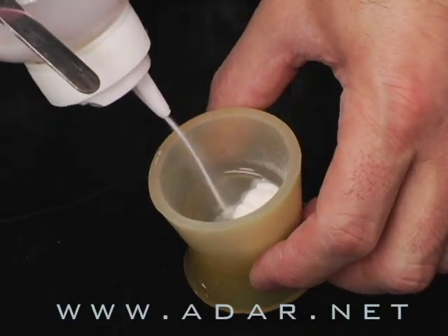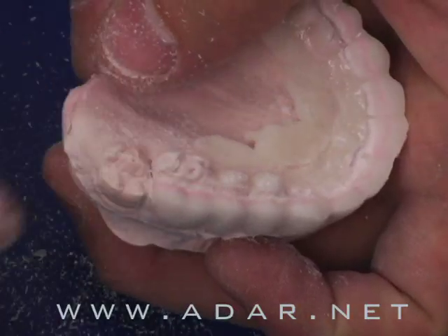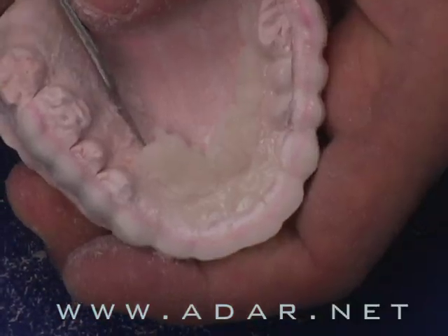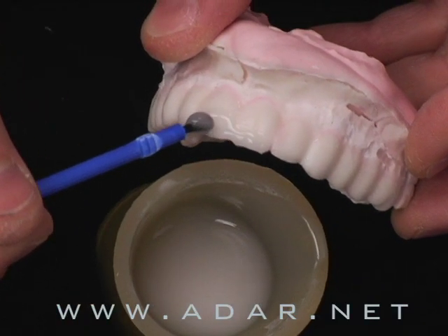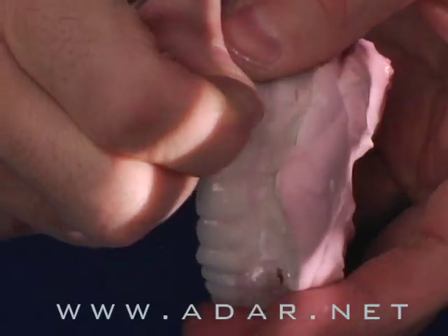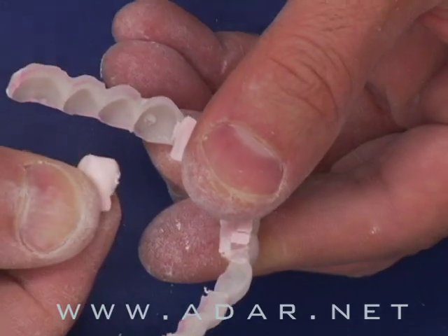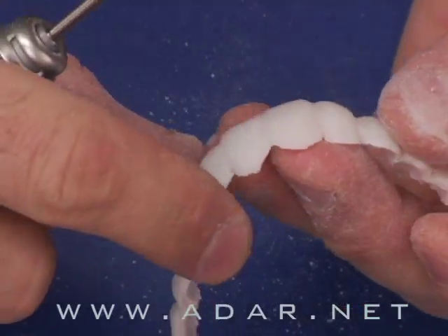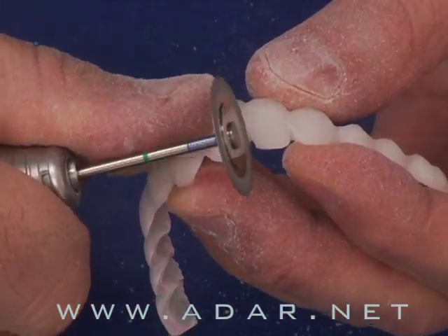We'll use cold-curing acrylic from Outline and a two-layer approach — one is dentin and one is incisal — with the sandwich technique. You can teach your assistant or your technicians how to produce this device. I will also teach you how to remove the working model from the device and shape it gently without breakage in one piece.